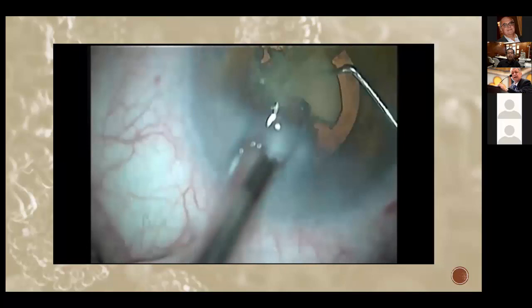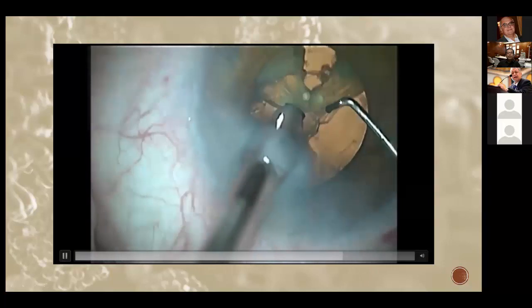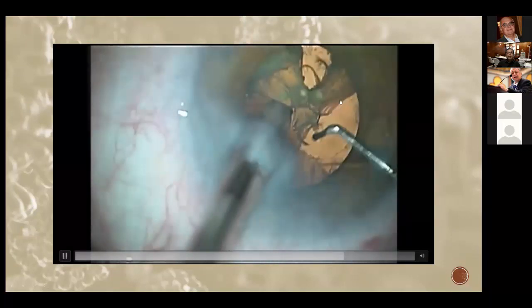try to look at the tip and the posterior capsule, you will see a very evident sign in a minute. And there you see it. As I finish the last bit of nucleus, you will see spider legs appearing.